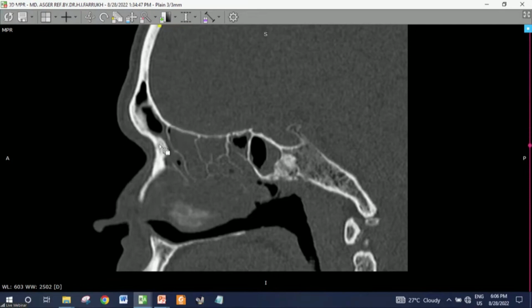Always see this. This is the beak. This is the frontal sinus drainage pathway, and this is narrowed by this cell which is attached to the posterior wall. Classical frontobulbar cell. So that was the only variety left, which is now with us in this case.